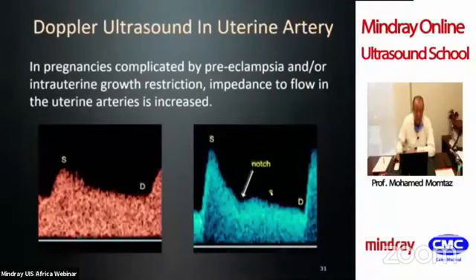With advancing gestation, the diastolic flow increases in the uterine artery and the early diastolic notch disappears, usually by 16 to 18 weeks. So once you find a woman pregnant at 18 weeks that has the same Doppler pulse waveform as the non-pregnant woman, this means the so-called placentation was not correct. So the formation of the placenta was not normal.